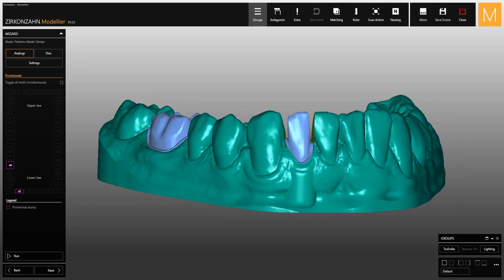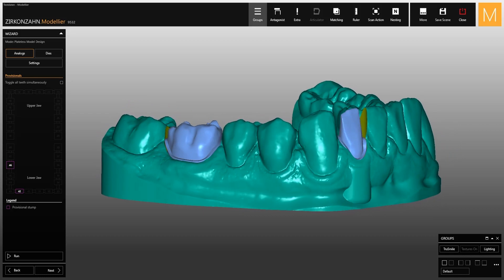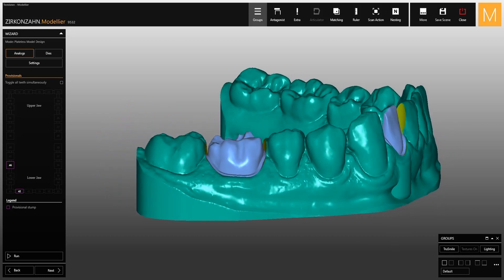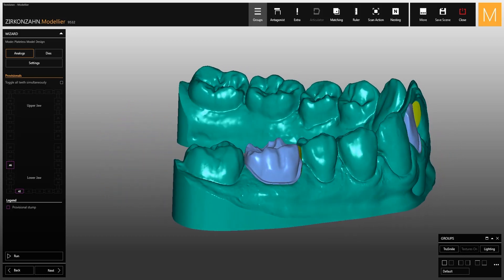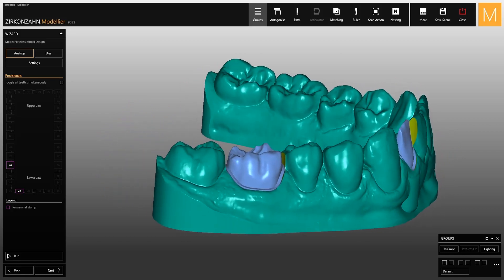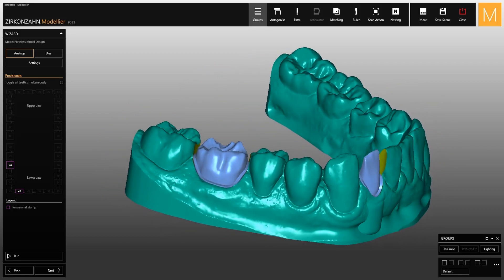Watch the upcoming videos on the new version of ZirconZahn Modeler to discover all the features of the software.